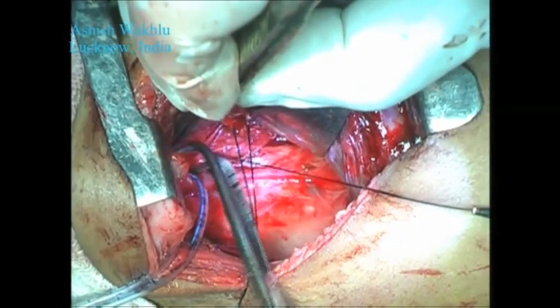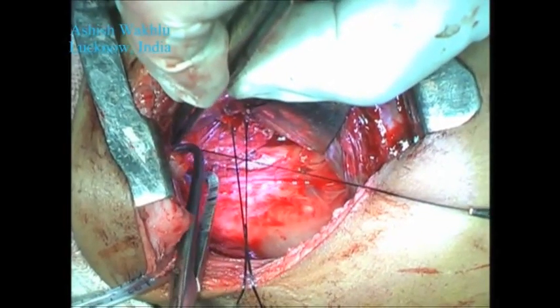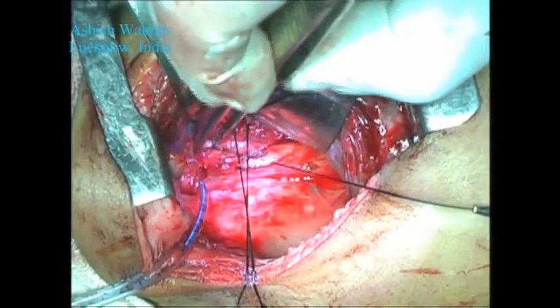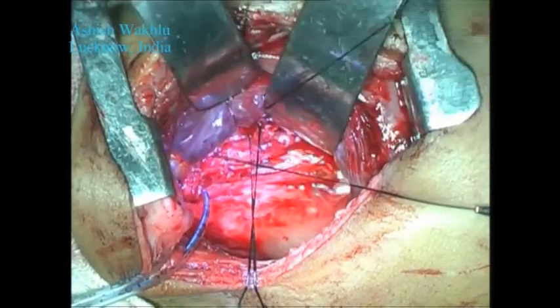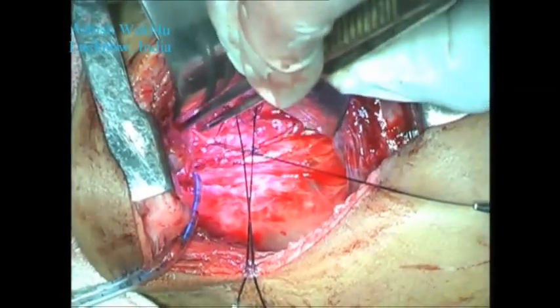A feeding tube has here been used to protect the azygos vein, as the stump of the bronchus is lying underneath it. There is a lot of fibrosis enclosing the azygos vein as well.